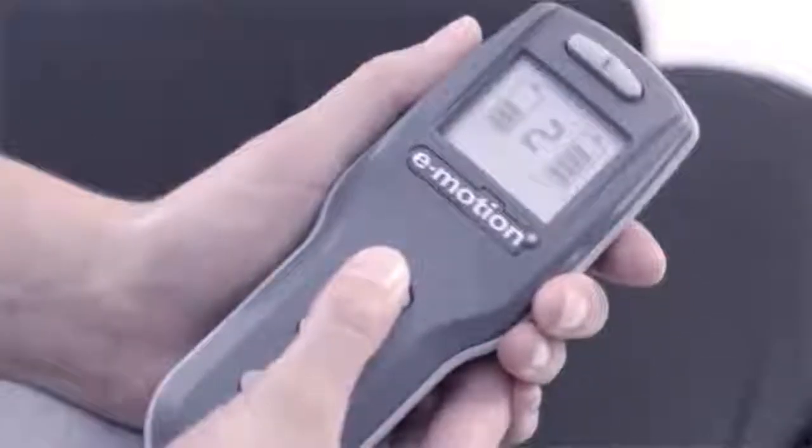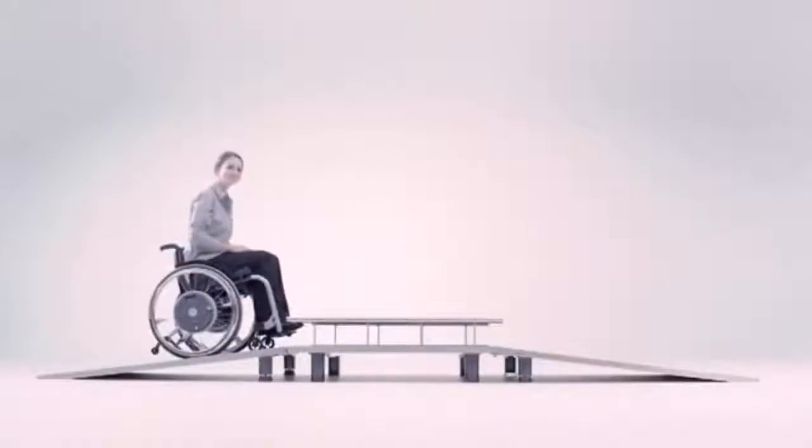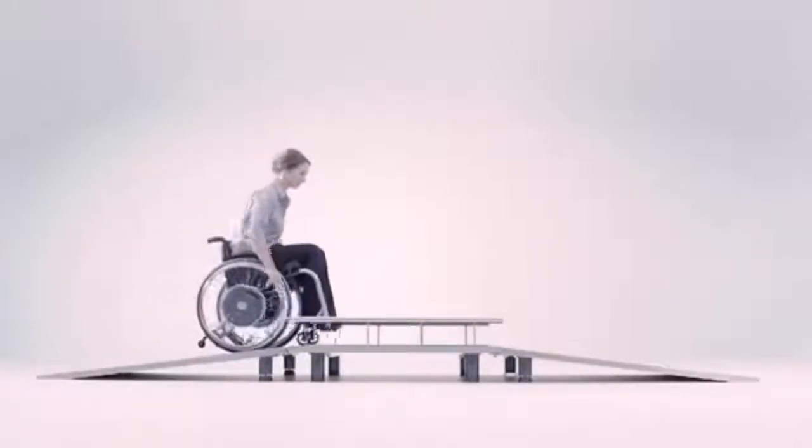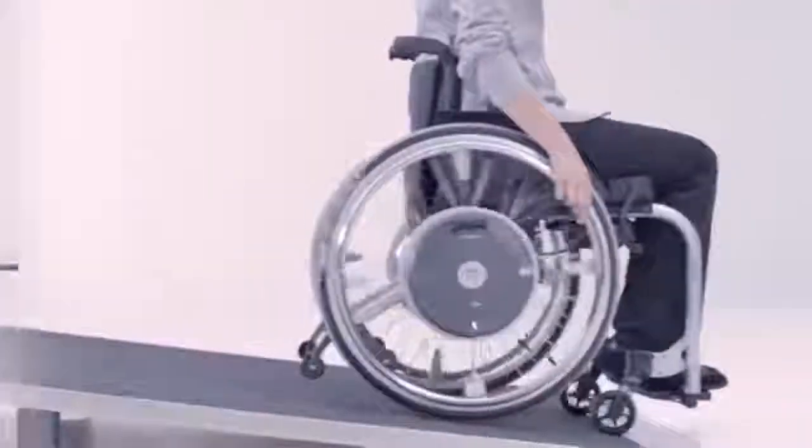A rollback delay activated at the push of a button keeps you safely in position when going uphill. When travelling downhill, the power assistance also boosts the braking pulse to give you greater safety.